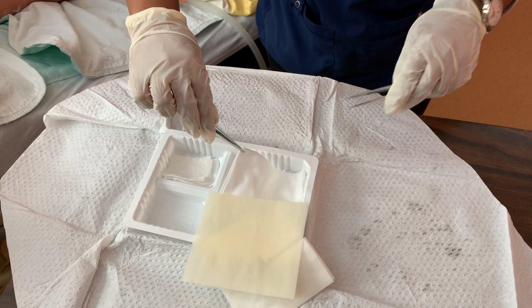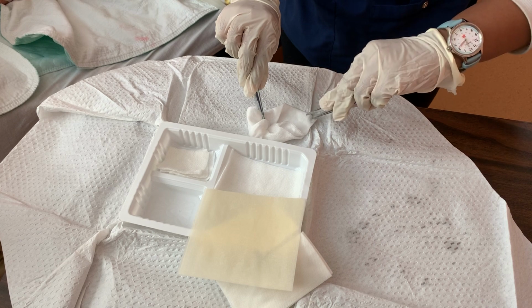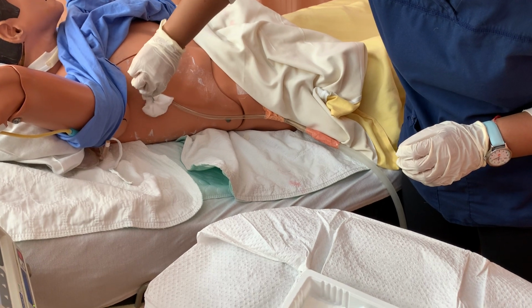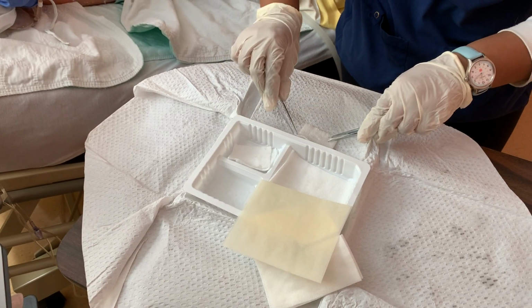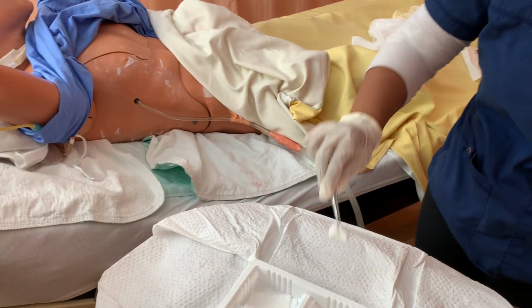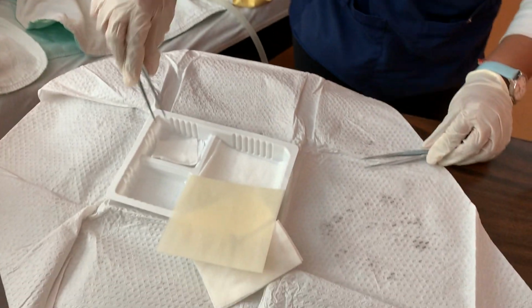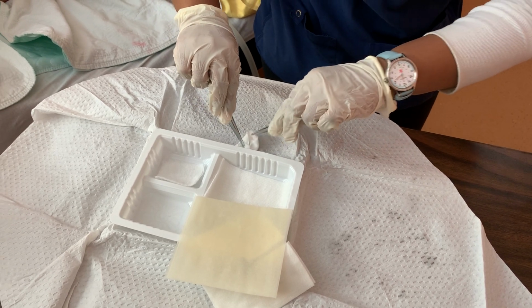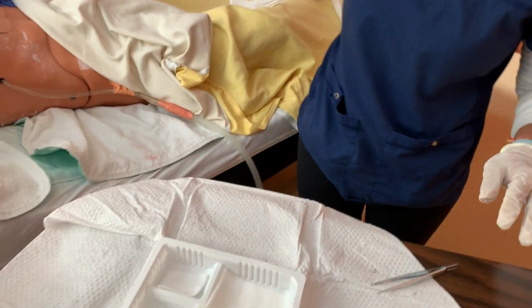I'm gonna now dry it. I'm gonna take a large 4x4 just to clean the surrounding skin. There we go. So I'm just gonna clean the entire area that I just washed. Throw it out. I'm gonna dry the bottom as well of the tube. And again, just making sure I keep my forceps sterile. Dry the top. Okay, clean, dry, assessed, looks great.